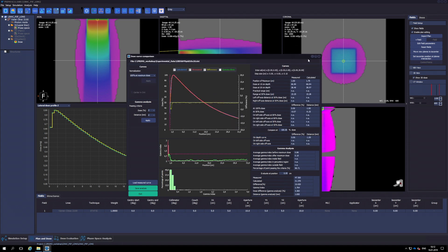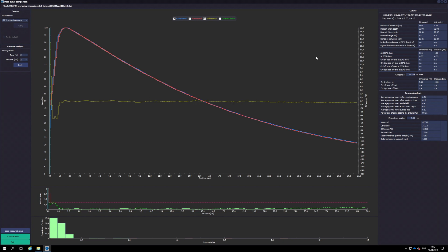The Dose Curve Comparison window shows a plot of both profiles together with a plot of the difference.